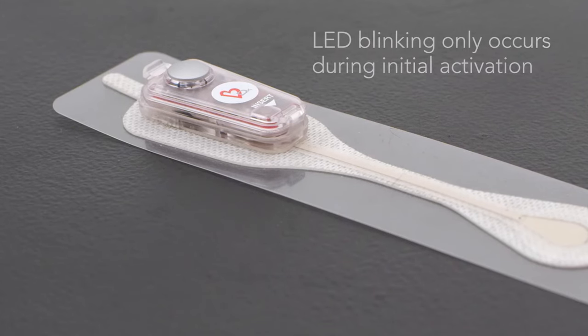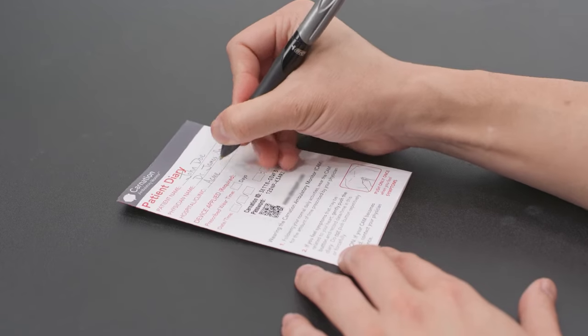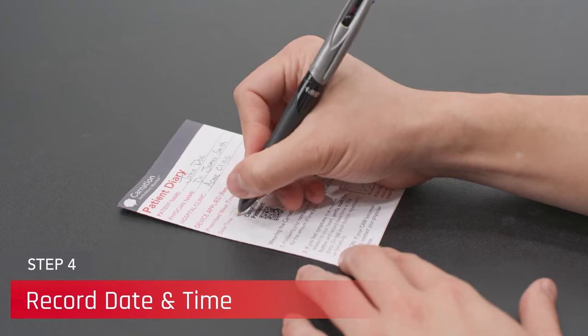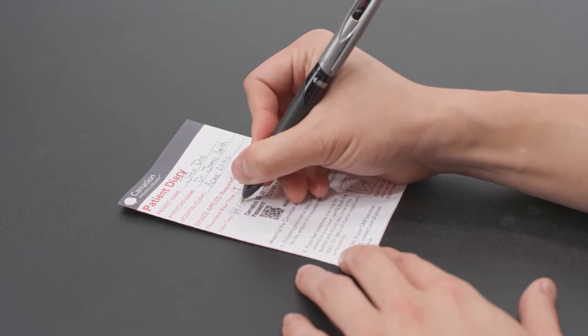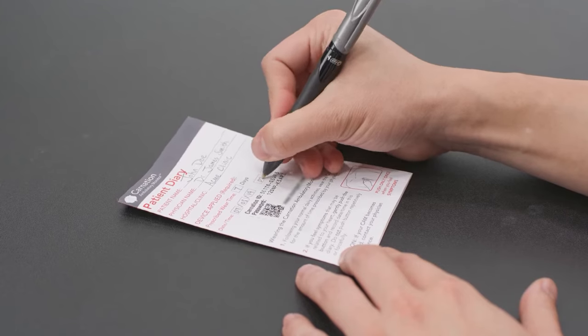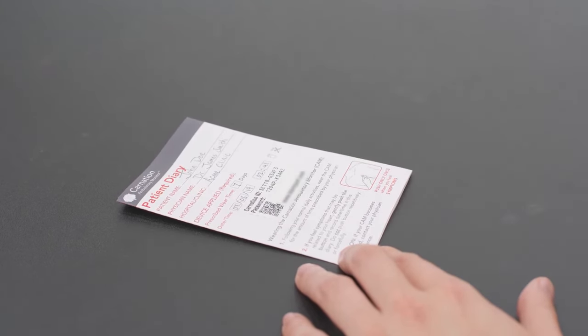Take a moment to complete the information requested on the cover of the patient diary, especially recording the precise date and time of when the CAM was activated. This information is required to complete patient registration and is vital for accurately matching the proper time of CAM activation with the internal clock in the CAM.